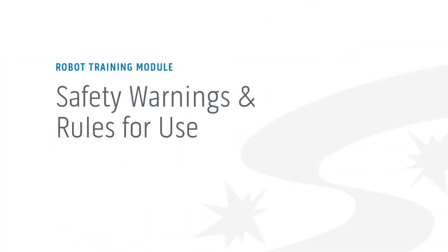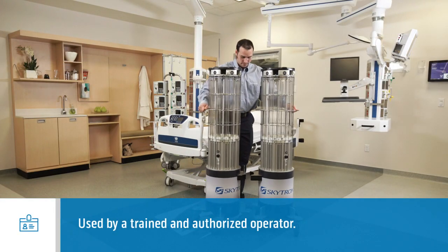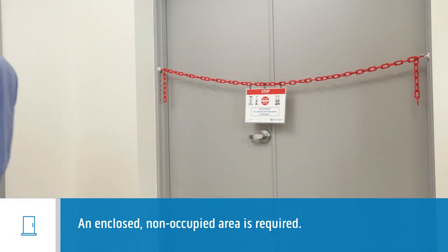Now let's go through the important safety warnings and rules for use. UVC robots may only be used by a trained and authorized operator. An enclosed, non-occupied area is required, and doors and windows must be closed at all times during operation.